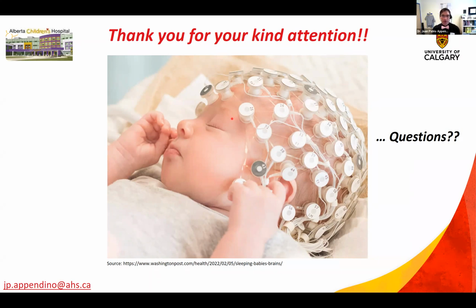Yeah, thank you. That's a very good question. Usually, in order to have good trends, we need at least several hours to understand the overall brain function. But in newborns, at least 1 hour of recording in order to see the healthiness of this brain activity, the awake and sleep cycling, is very helpful. But we tend to have at least 4 to 6 hours of recording in order to have a good understanding of the trends.